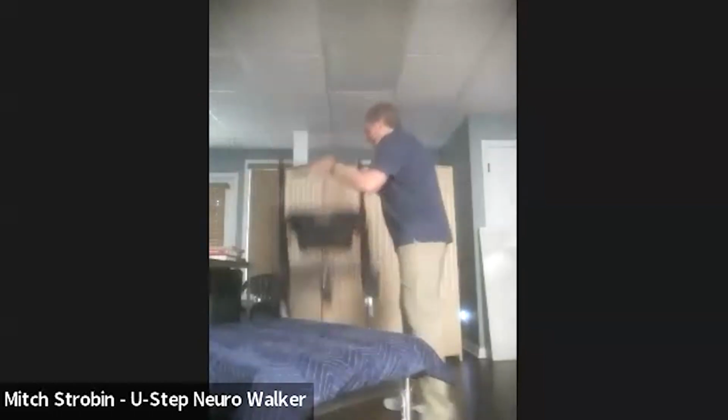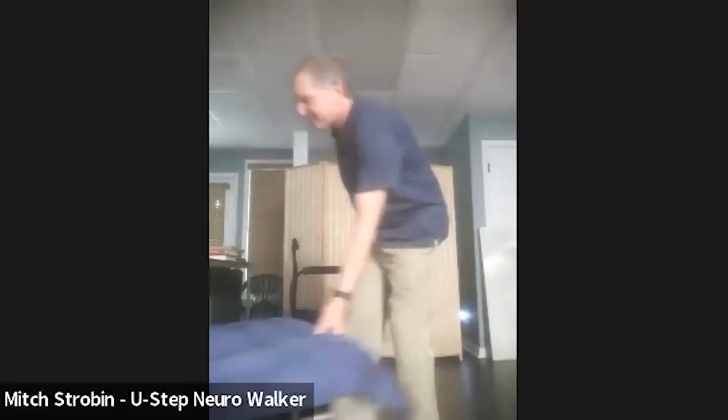That would be bad. But in the home, you have thresholds between rooms, maybe a sidewalk crack or a driveway crack. So the idea is just to lessen the impact. The last thing we want is for someone to roll over a bump and then overreact and possibly cause a fall. So just another safety element of the U-Step. There's nothing to do to set it up. Just like your car, the shock absorber is always there, always on. Okay, let us get off this table, and then you get to see me do whatever I'm gonna do.